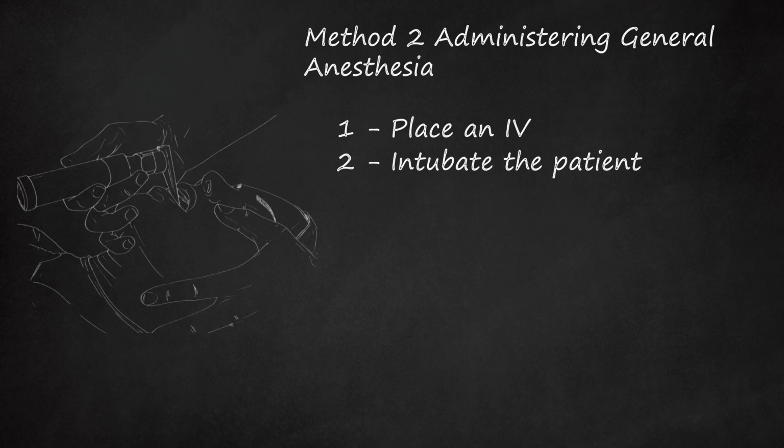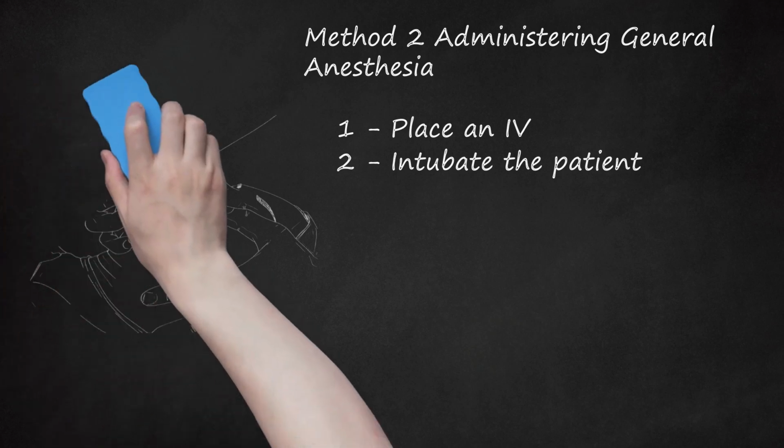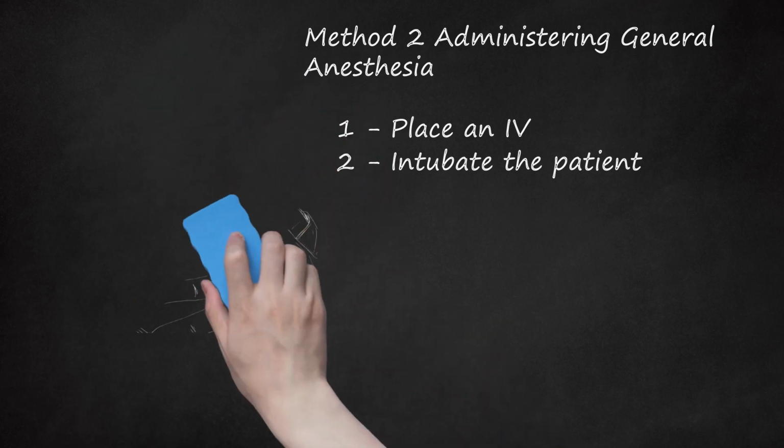Because intubation usually happens when the patient is asleep, patients may occasionally have a cut lip or chipped tooth if placement of the endotracheal tube was difficult. It is important for patients to notify their anesthesiologist if they have loose teeth, which can increase this risk. After surgery, some patients will have a sore throat from the endotracheal tube. This can last 1 to 2 days and is a normal side effect of intubation.